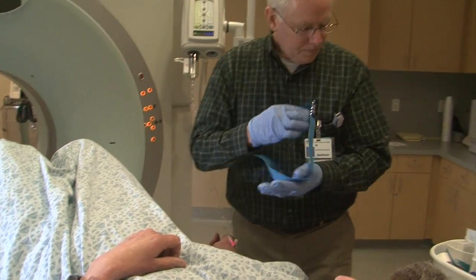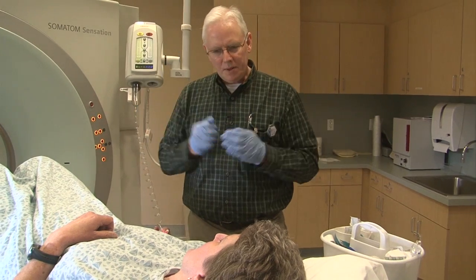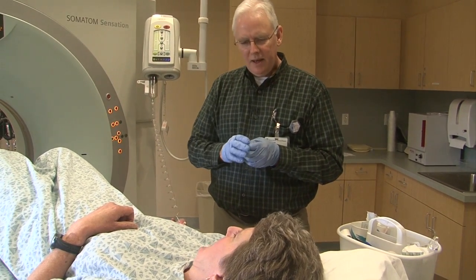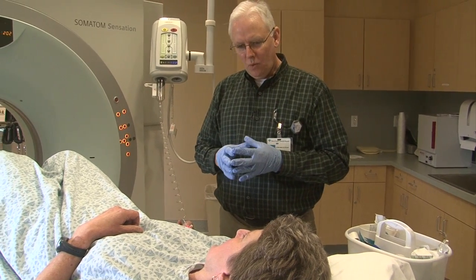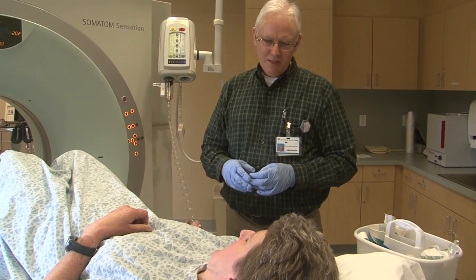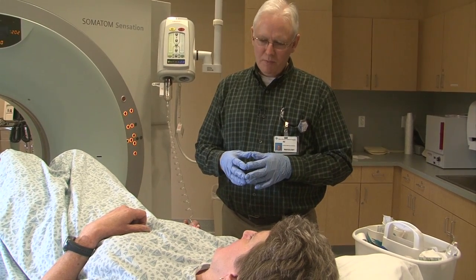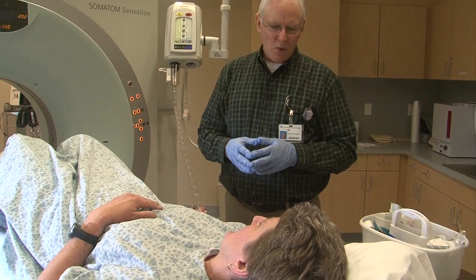Great. Now when we start the exam, I'll have you put your arms above your head, move you into the machine about mid-chest, and you'll hear a recorded voice talk to you. It's one of my co-workers, so it'll be a female voice, and she'll let you know when to hold your breath, when to breathe. Are the breath holds very long? It's about 15 to 20 seconds.